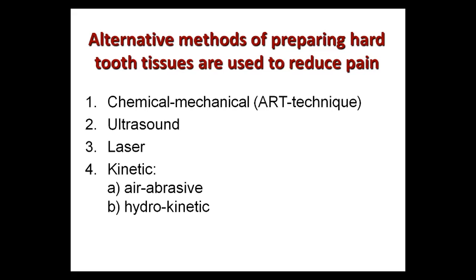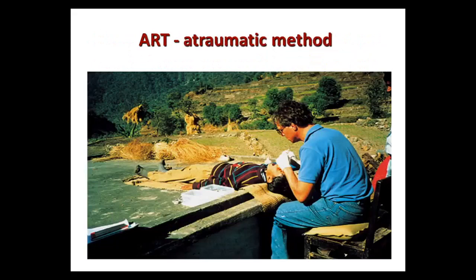First one is chemical mechanical preparation, ART technique. Next, ultrasound. The third one is laser. And kinetic with two kinds, air abrasive and hydrokinetic preparation. First, the atraumatic method, chemical mechanical preparation.